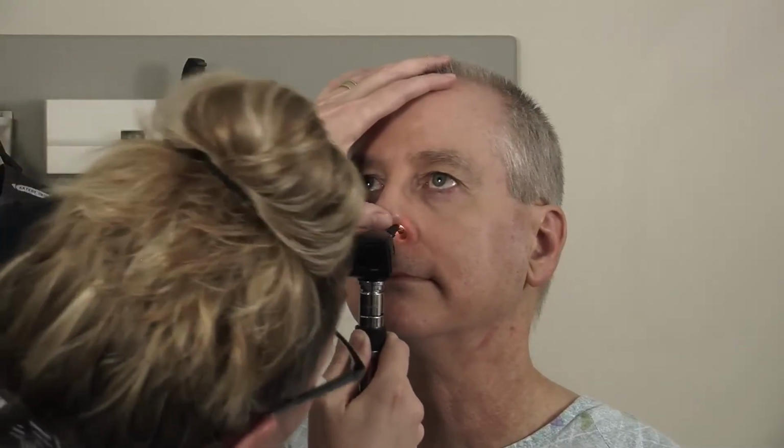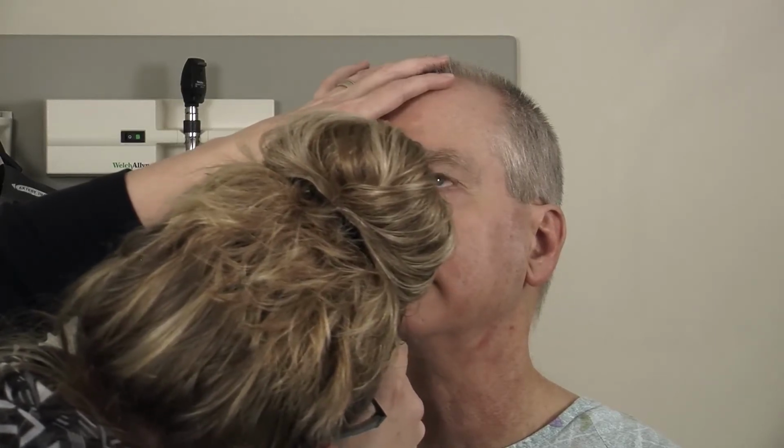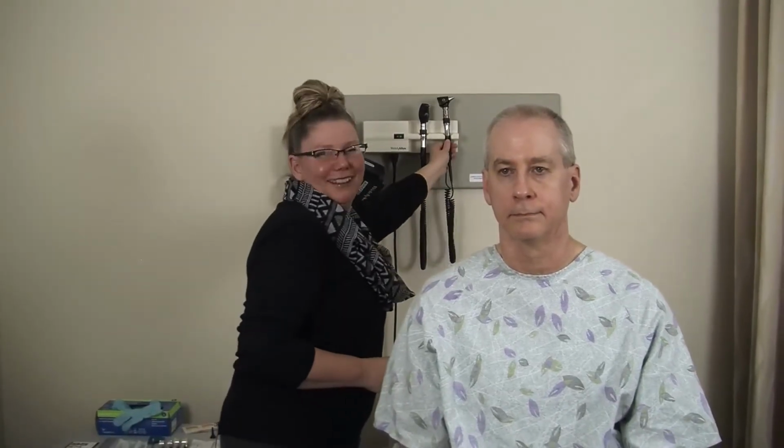And same thing over here. Good. And you want to be careful not to scrape the septum. It's a very sensitive part of the nose that can be uncomfortable for the patient in the event that you scrape the septum of the nose.